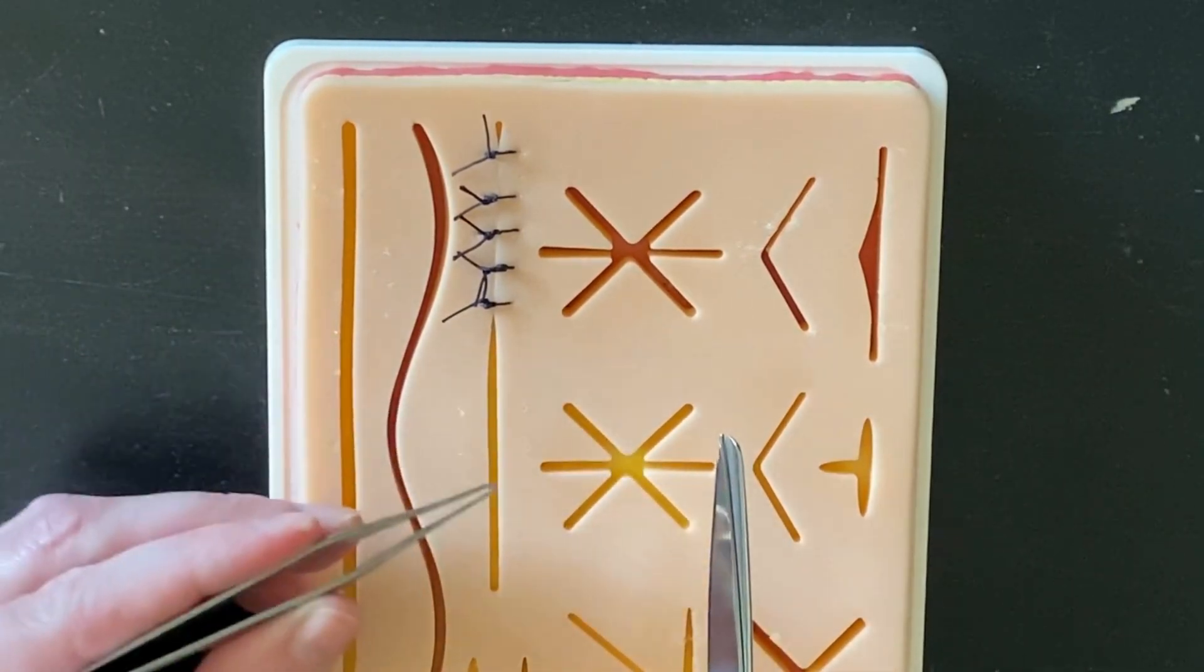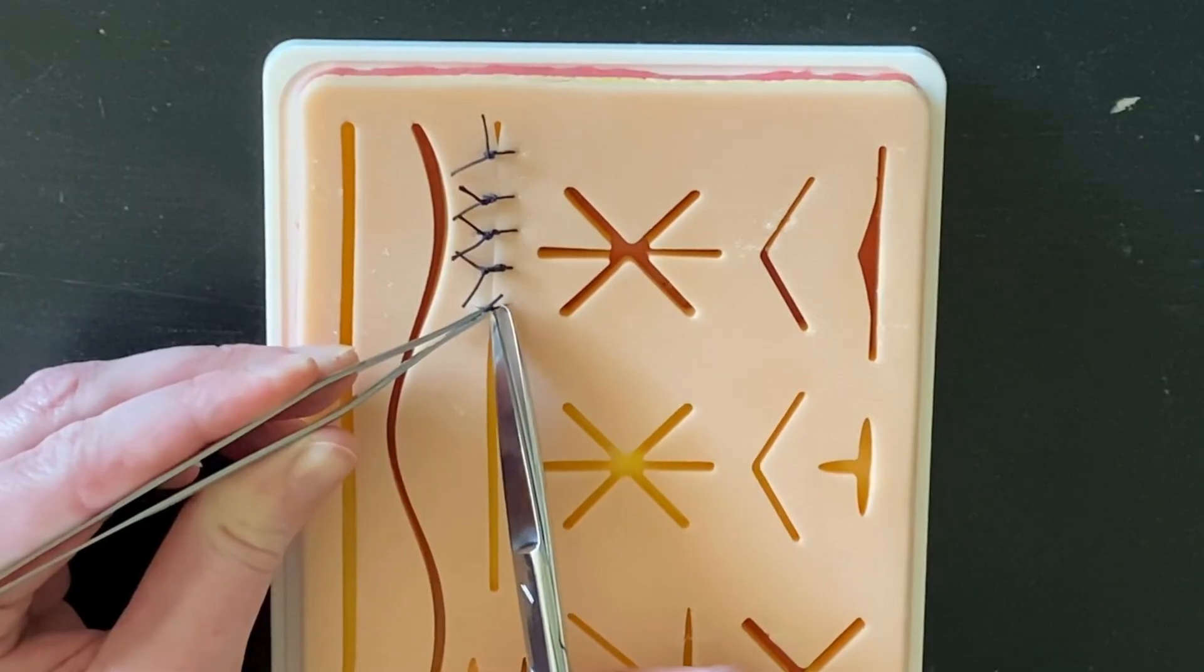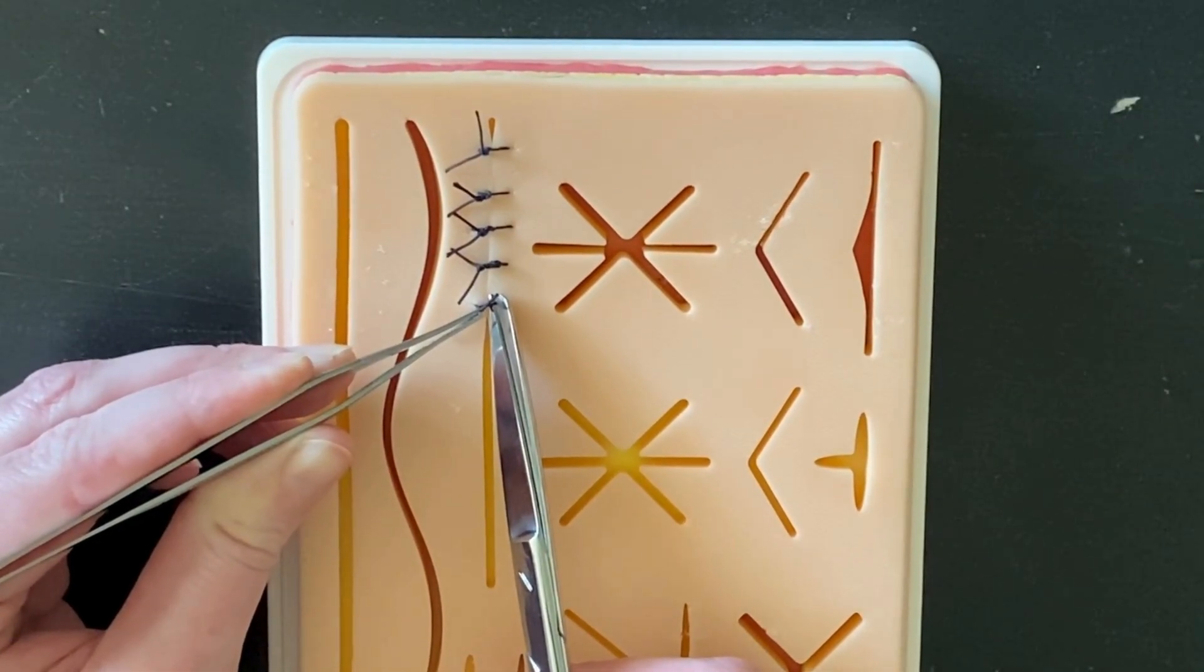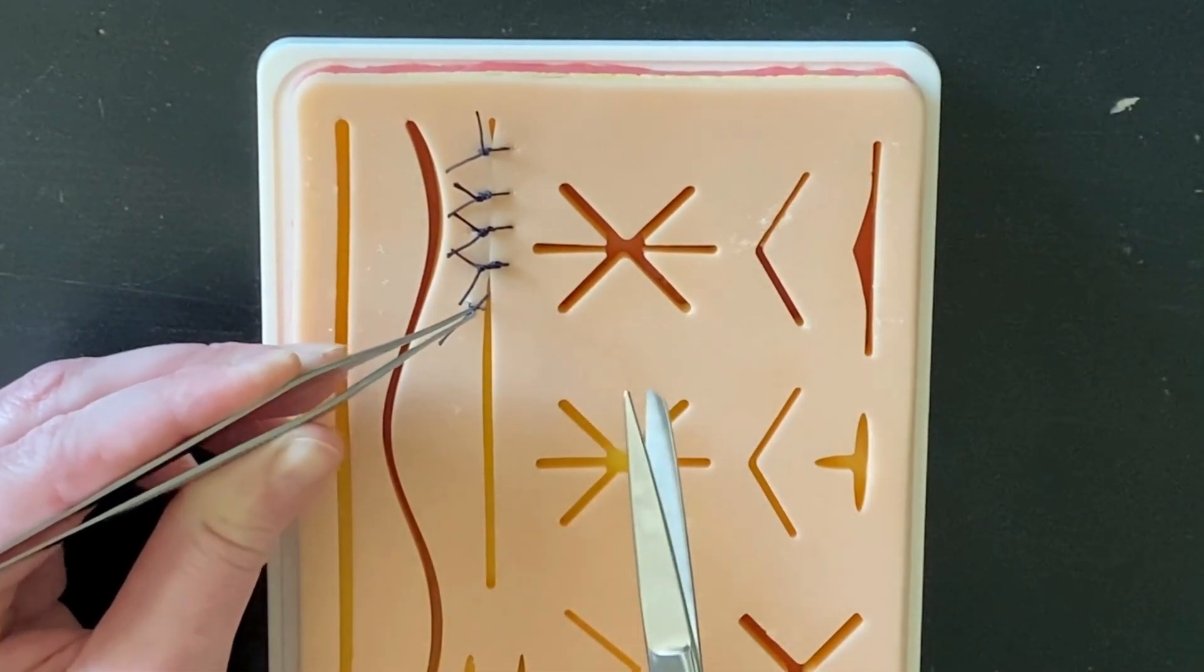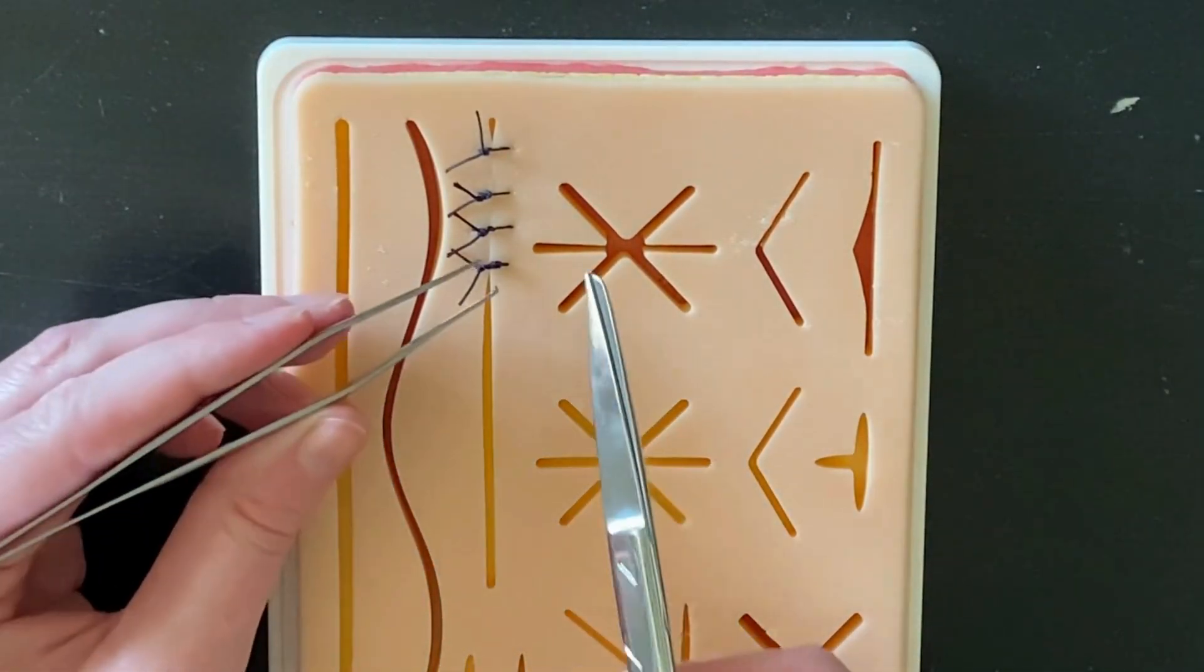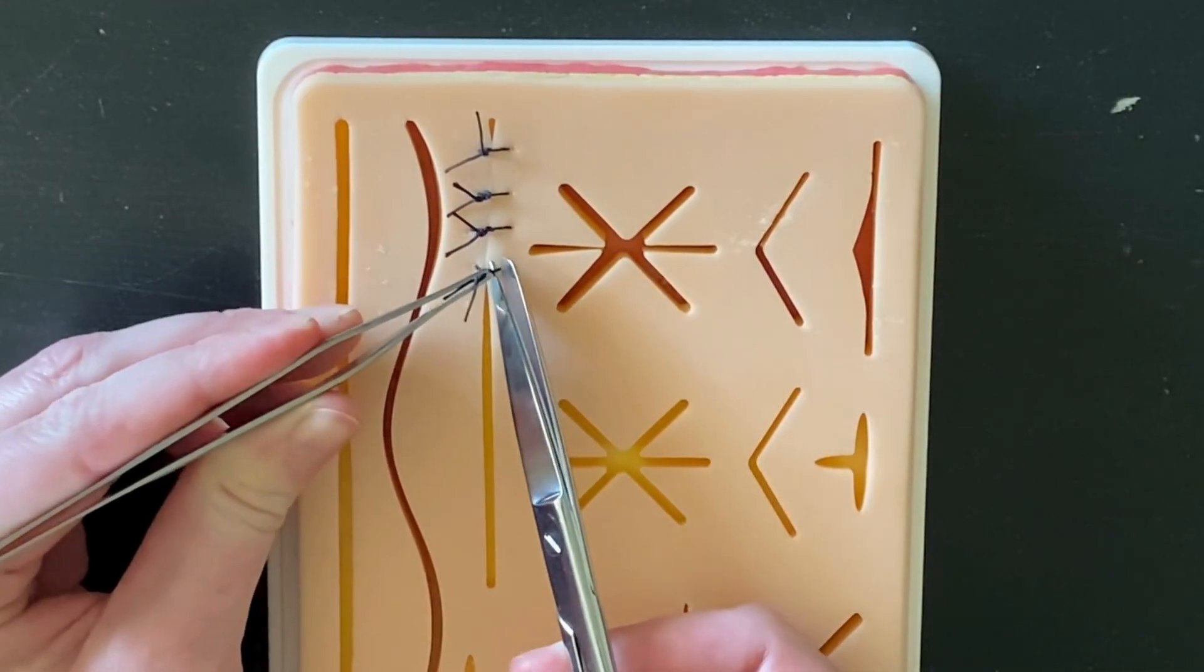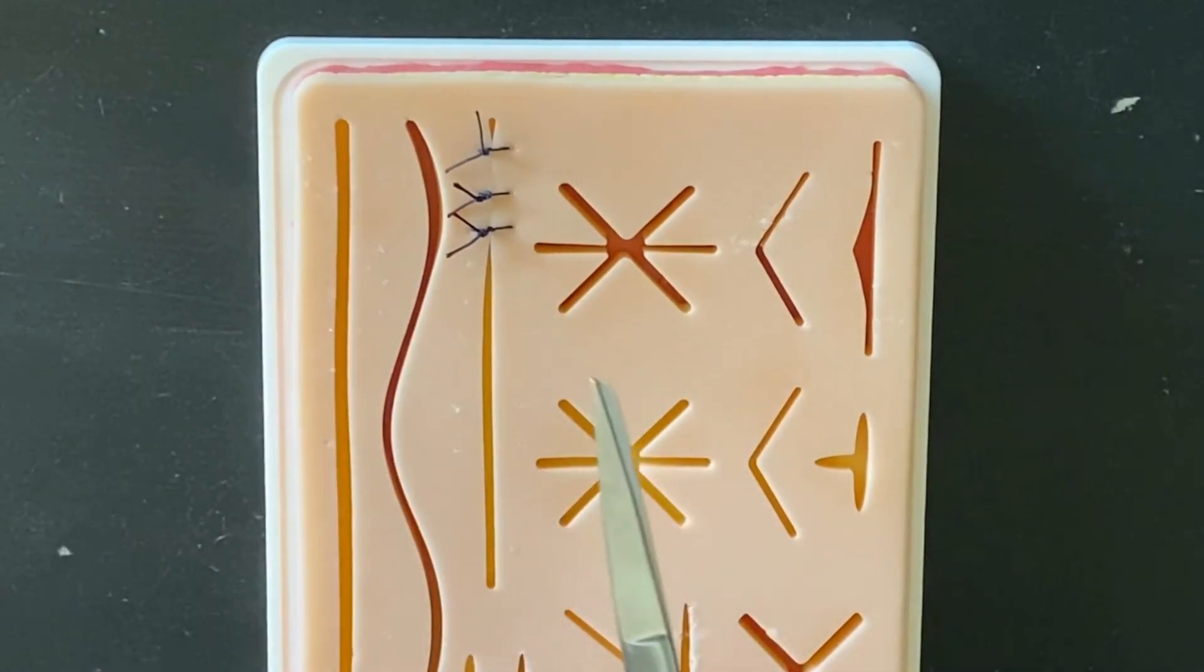Sometimes you'll find that the sutures are going to be buried. That's when it's important to give that tension so you can sneak that tine underneath. The iris scissors or curved iris scissors may have a finer tine that will give you a bit more fine motion to get underneath that knot as well.